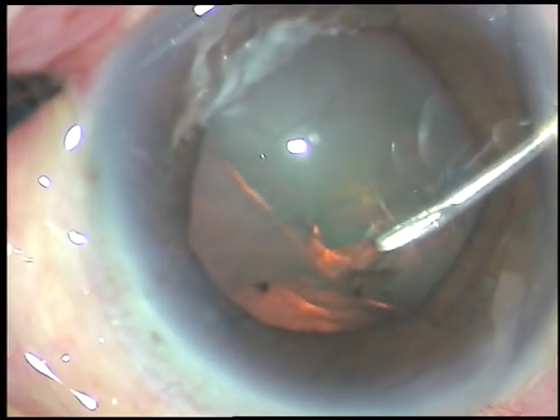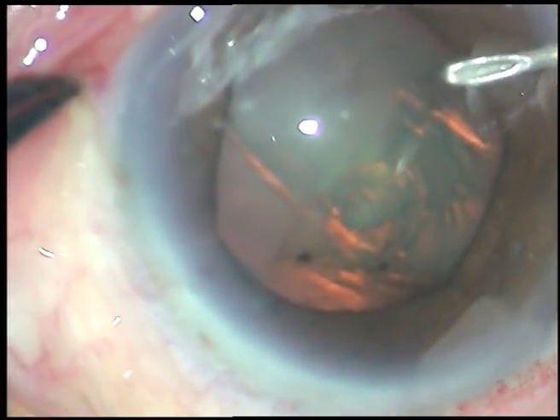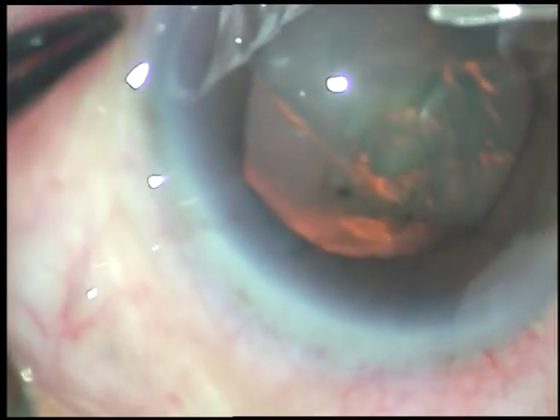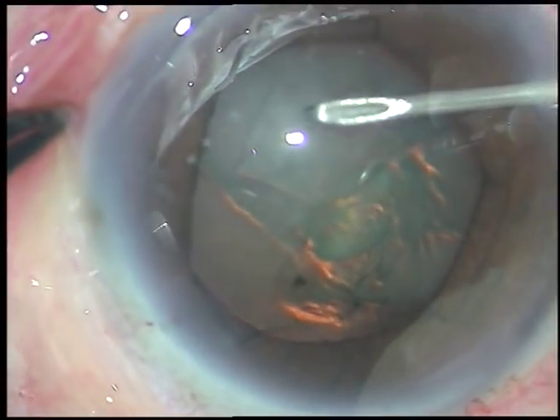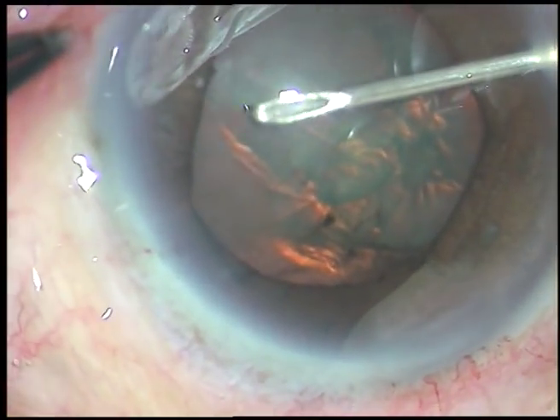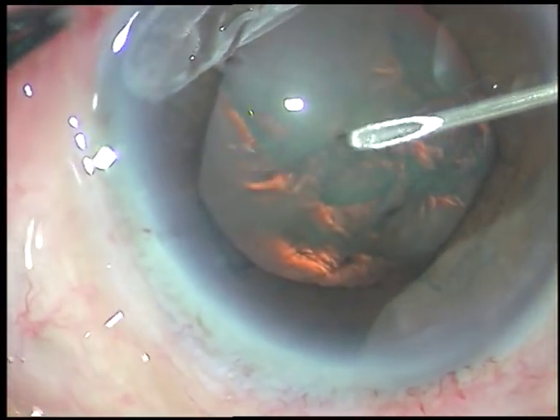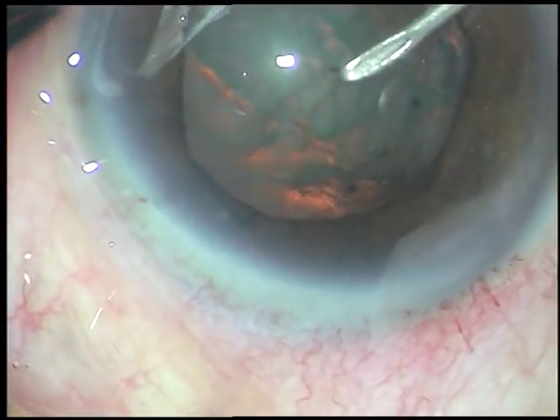Now this is capsulorhexis. Since the anterior chamber is very shallow in this case, I didn't want to use the utrata. At some point I made a scratch on the corneal endothelium, and an endothelial flap was created — we will see that later. But that flap didn't come off; I could tamponade it with a small air bubble and ask the patient to lie down for about six hours in supine position. The rhexis is in progress with the 26-gauge bent needle and it is completed.